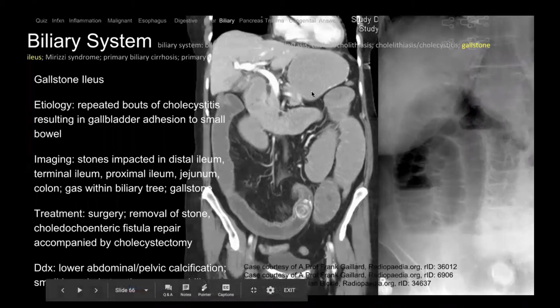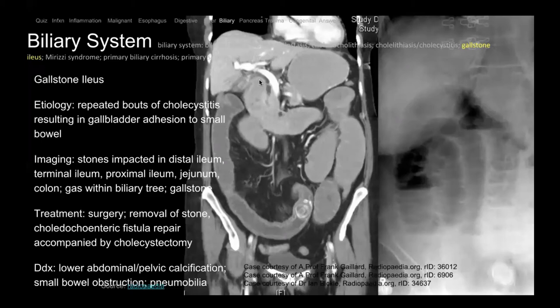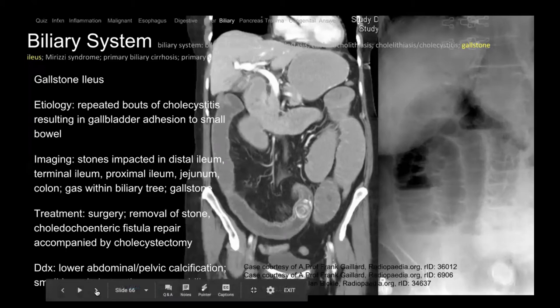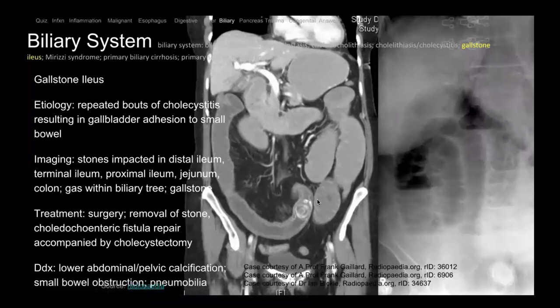Here's a gallstone that has migrated into the ileum — this is called gallstone ileus. There's an abnormal fistula between the gallbladder and duodenum, the stone goes into the bowel and causes a distal obstruction. You can see the transition point with the stone and markedly dilated upstream bowel. It's actually a misnomer — it's really a mechanical obstruction, not true ileus.